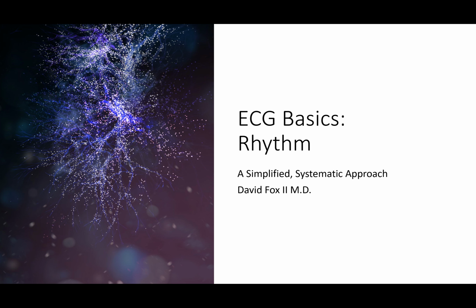This time we're going to be focused on the rhythm. Hopefully you've watched at least the introductory lecture that gave the basic outline for what we're doing in these lectures. We're looking at a simplified systematic approach to looking at an ECG and coming up with a final interpretation, but we want to go through step by step along the way so that we don't forget anything or miss anything that might be important.